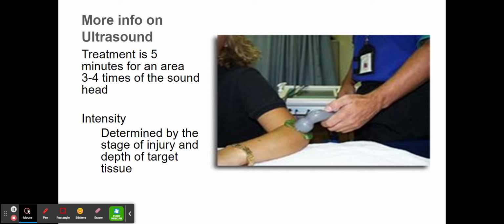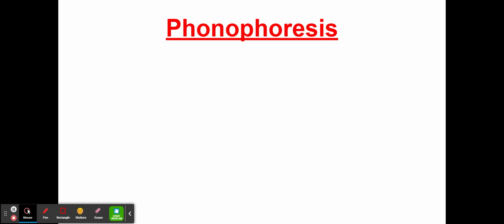Intensity is determined by the stage of injury and the depth that we want. If it's something superficial, then we'll use less intensity. If we want something deeper, we have to use a higher intensity.